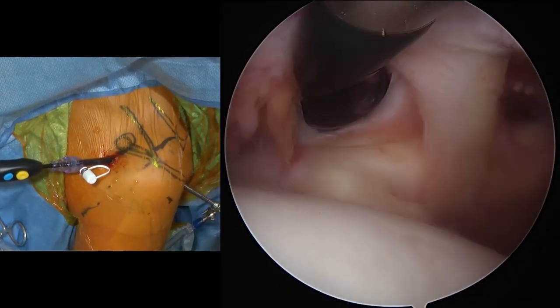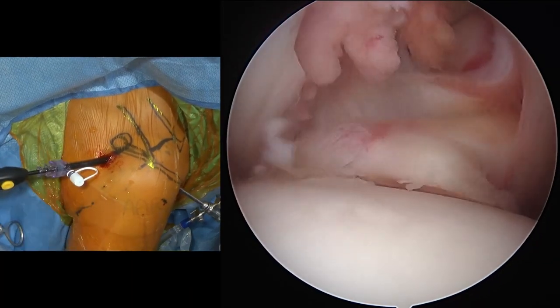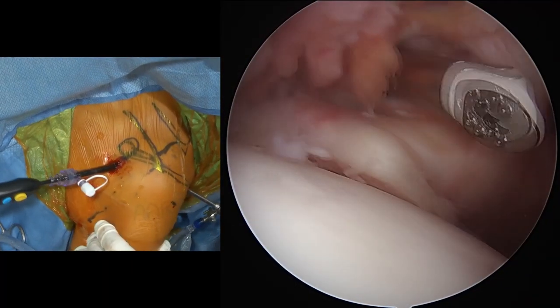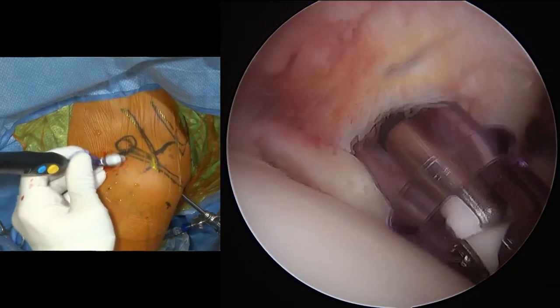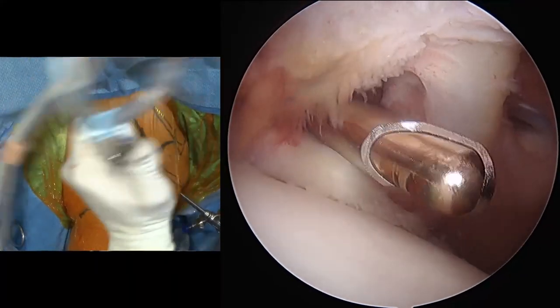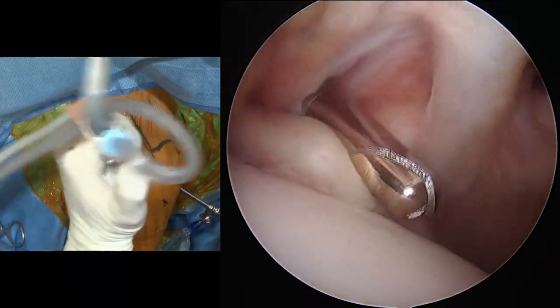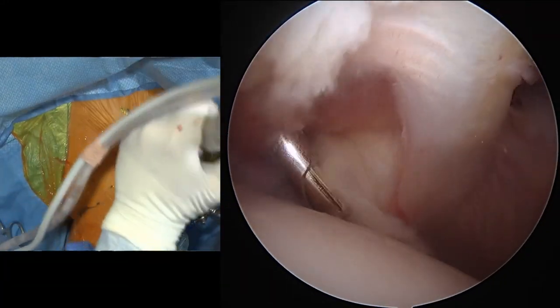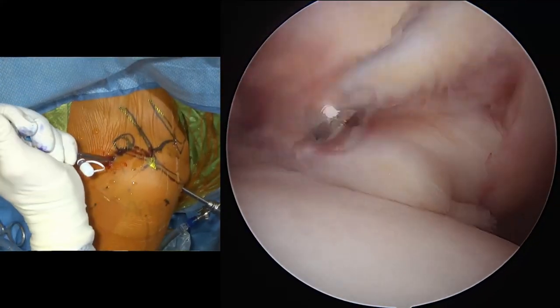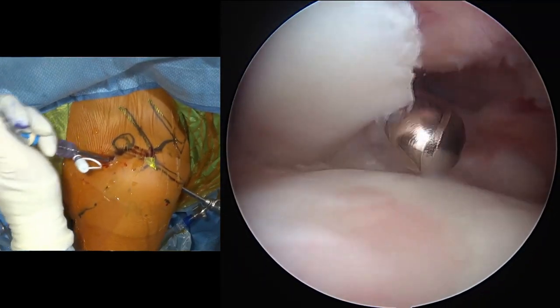Here's the upper edge of his subscap, so hold the arm right there. And we'll do what's called a lever push. So holding the arm there, we'll pull back on this and see if there's any separation. And there's definitely been partial injury here, so we'll have to take a closer look. So let's have the shaver back again, please. Our biceps tendon, we'll just kind of trim that back a little bit so it stays out of our way.